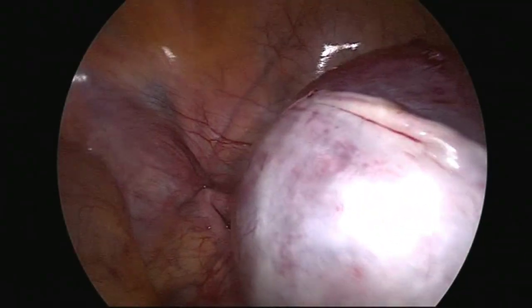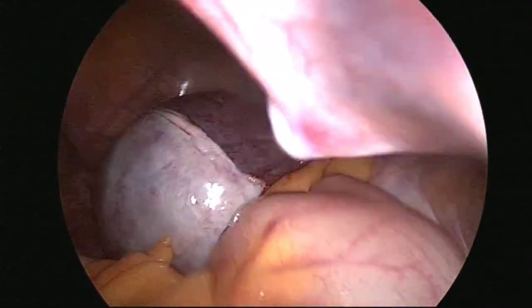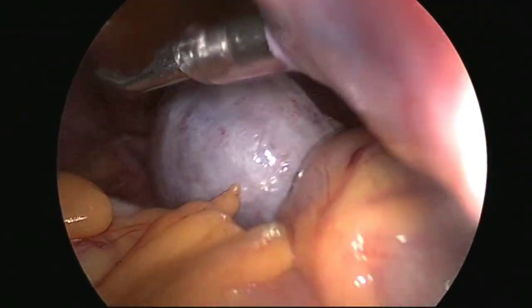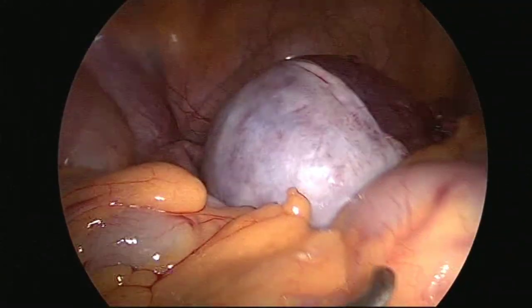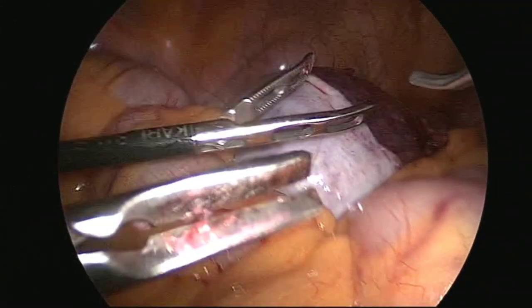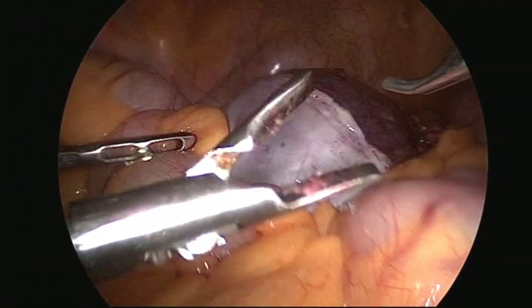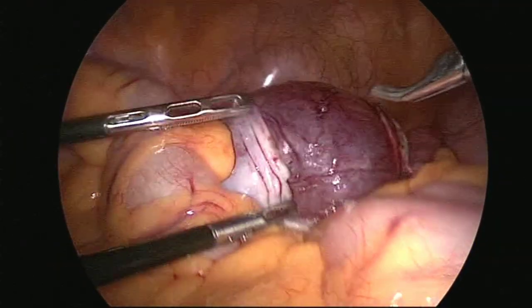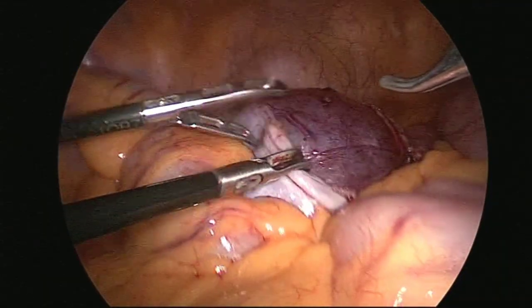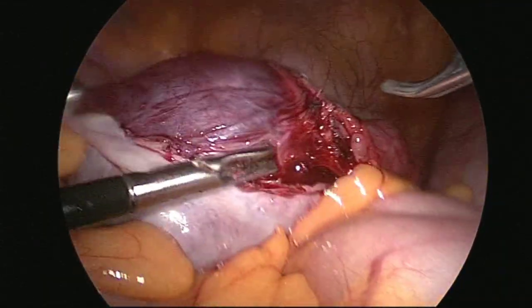I think this is the best way to operate a simple ovarian cyst. And the most important thing in that kind of cyst is just to find the good plane. Once you reach the good plane, after that there is no difficulty at all.